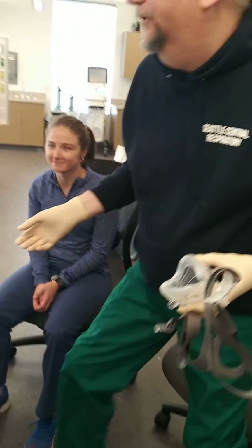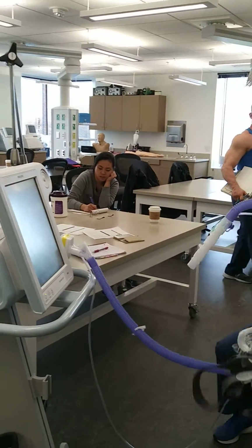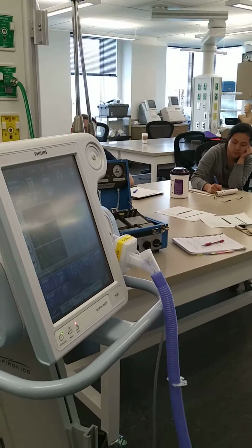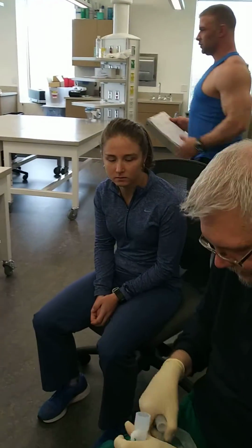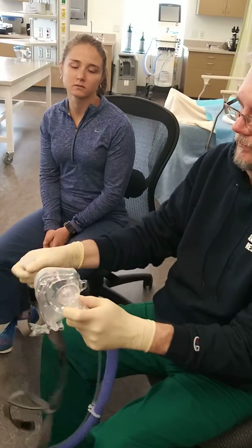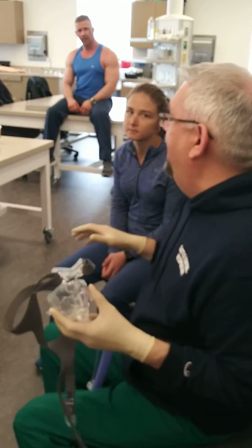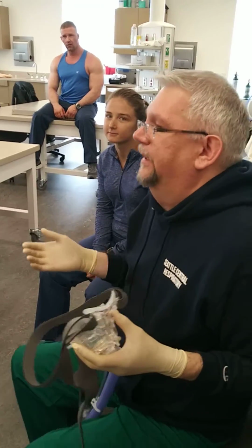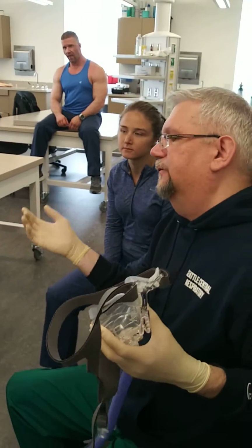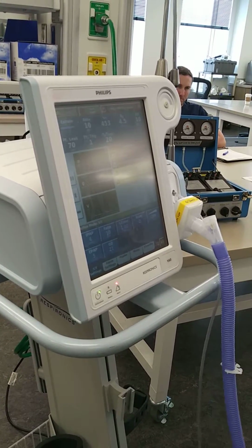Okay. All right. So I'm going to take my machine here. And what I would do is turn the machine on, and I would hook up the mask. And then it doesn't matter what my orders are. At this point, I'm going to start with some very low settings with anybody. So even though I might want to end up on 10/5, I'm going to turn it down to like 6/5. And I don't need an order to do that. I'm just getting the patient used to it.